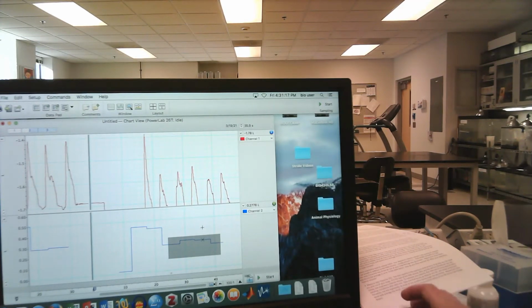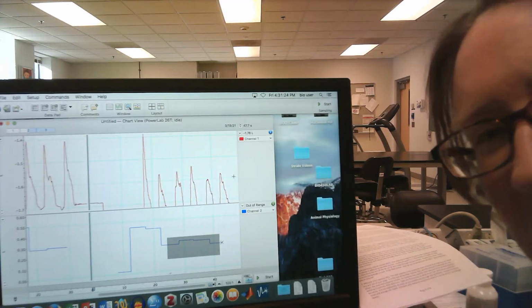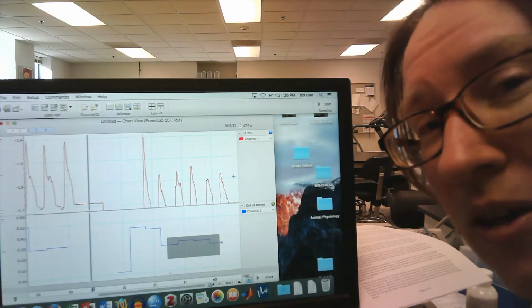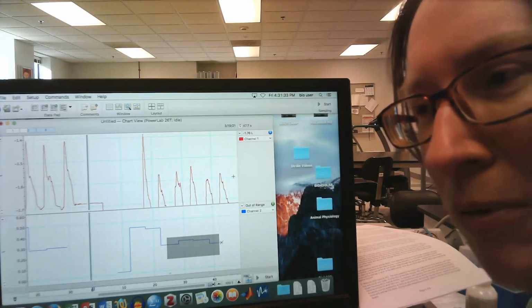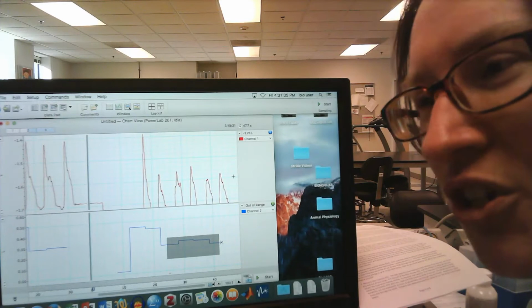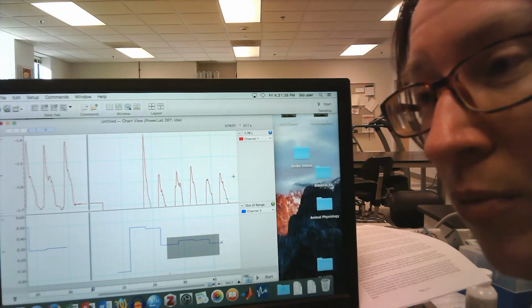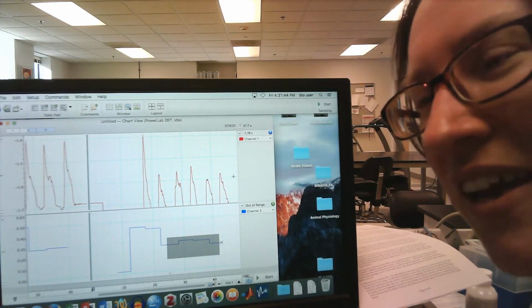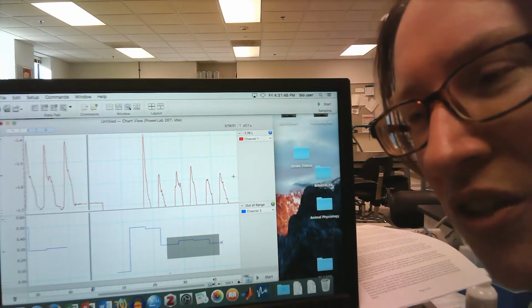So having seen that, hopefully that gives you a way to imagine how else you could use the spirometer to measure other aspects of your breathing function. So for example, if you wanted to measure your expiratory reserve volume, what you could do is breathe in normally, breathe out, and then force air out of your lungs and measure that, and that would tell you your expiratory reserve volume.